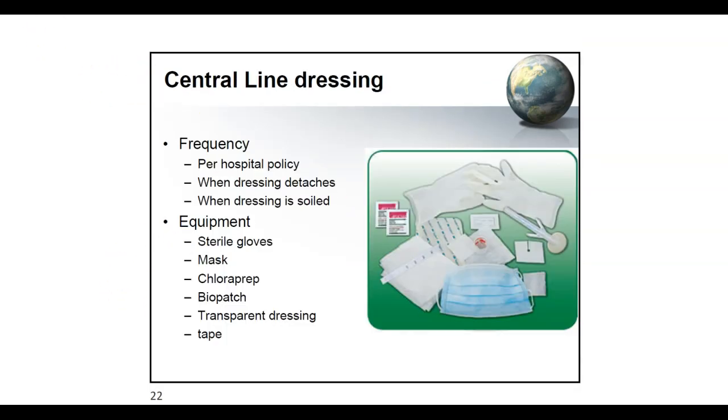As mentioned earlier, part of the care for patients with central lines is that we have to change their dressing. So dressing change, again, it depends. It's per hospital policy, so make sure you're asking your nurse, you're looking at their policies and procedures. But most often, it's every week. Or sometimes even if, let's say, a week hasn't passed yet, but then the dressing is coming off, or the dressing is really dirty or moist, then you may want to change that, right, to prevent infection. So what do you do? How do you do dressing changes?